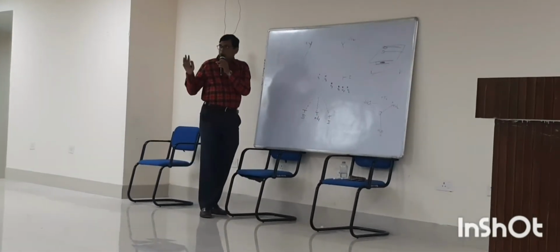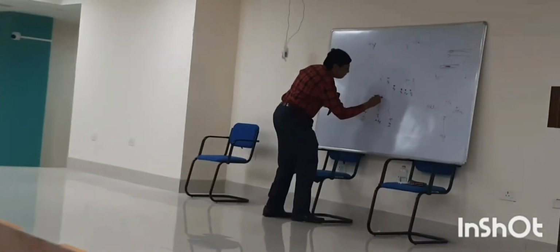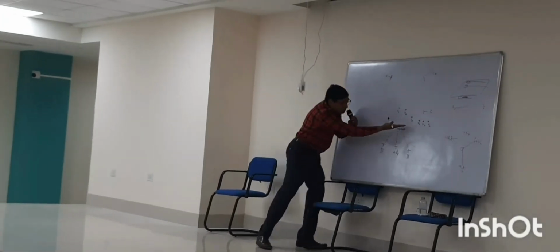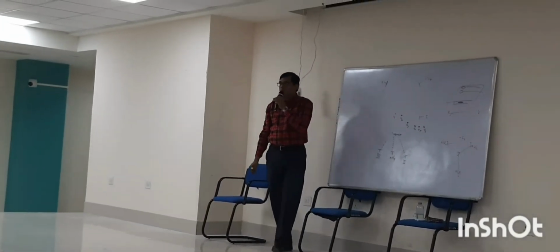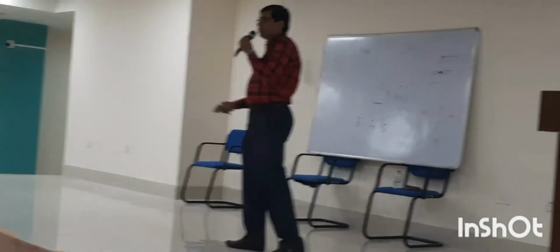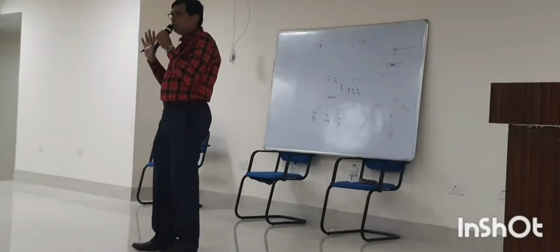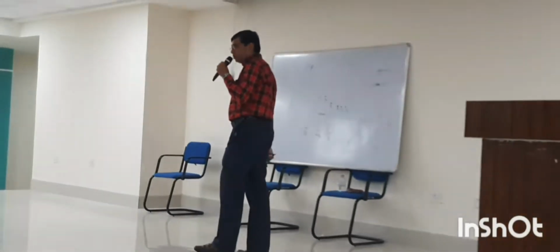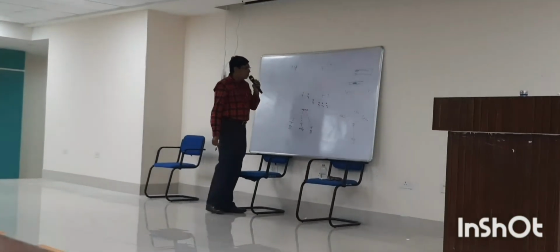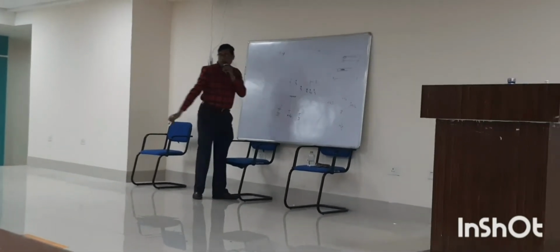If we consider this is the inferior wall of the heart, the inferior leads are lead 2, lead 3 and AVF. So whatever recordings we get are of the inferior surface of the heart. And this is the anterolateral surface of the heart.